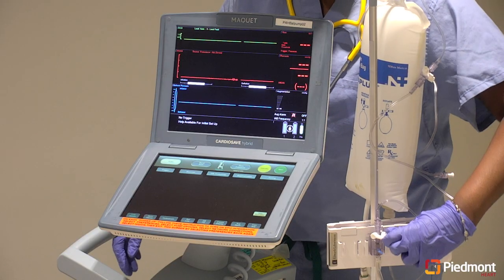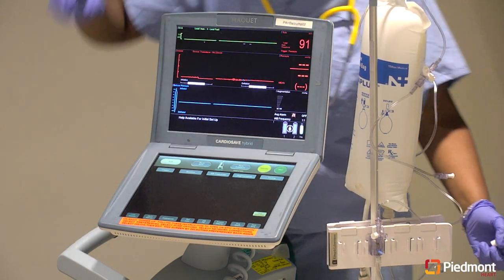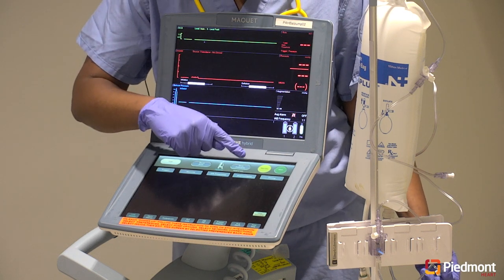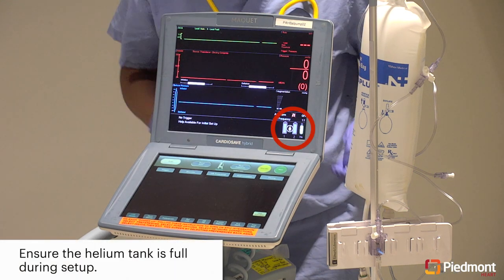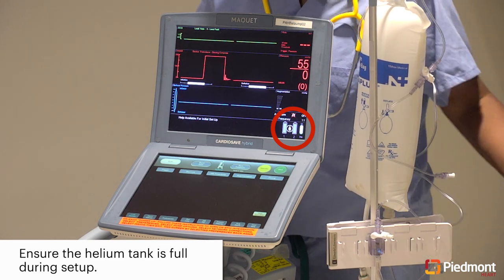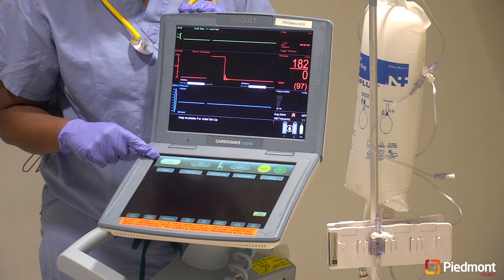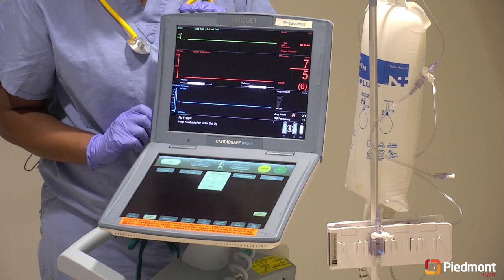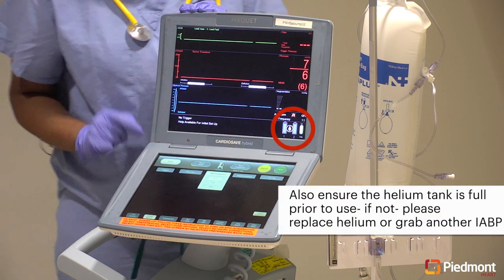You now need to zero the transducer to get a pressure reading. There's no need to level if you are using a fiber optic balloon, as we are here. Ensure that the setup is in auto and one-to-one configuration. At this point, the console is automatically in standby and it can stay like this for hours. Do not press start here.